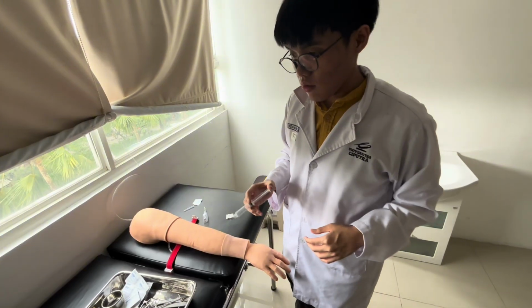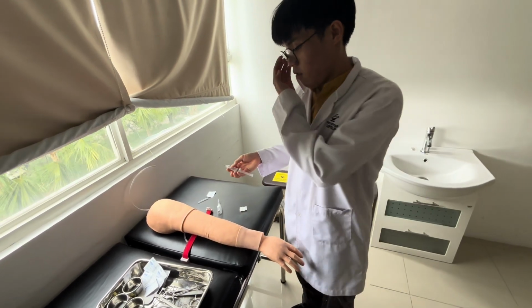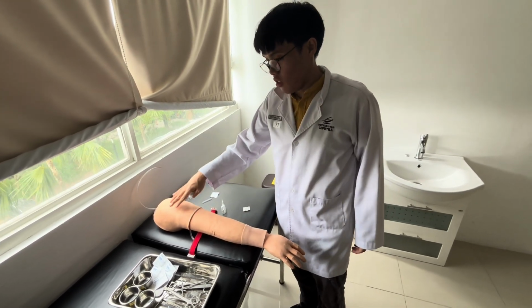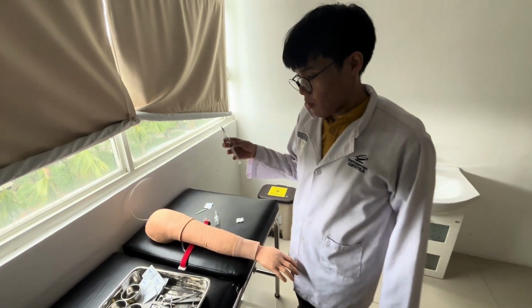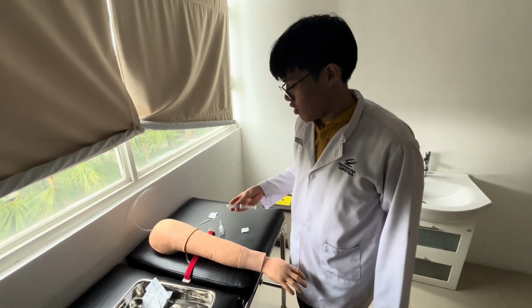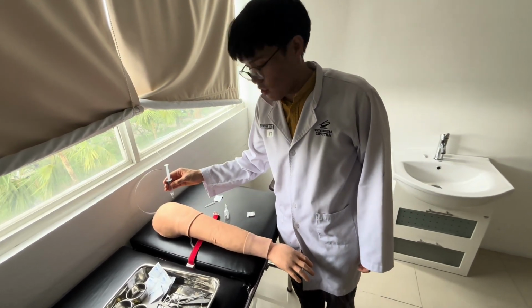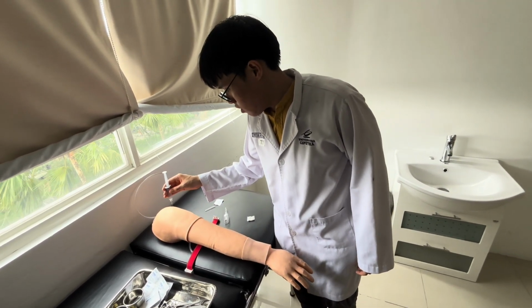Okay, cut. So now for intramuscular injection, we will be conducting it around the deltoid region. So let's assume the medication is already in the syringe, and then what you will do is insert it at 90 degrees, like this, 90 degrees.